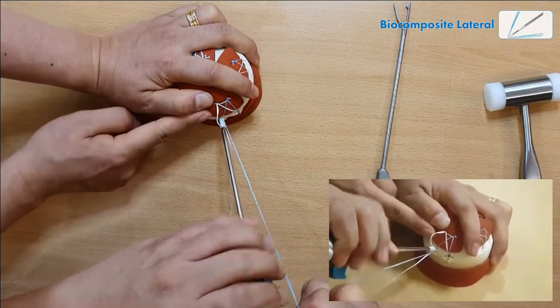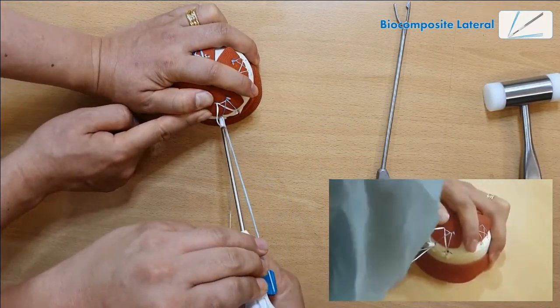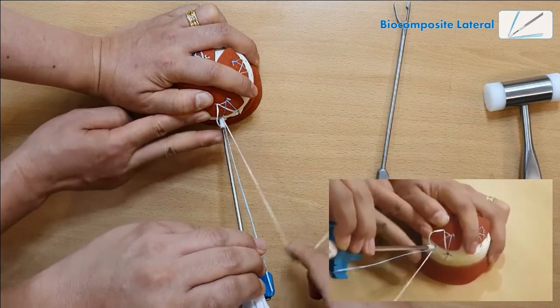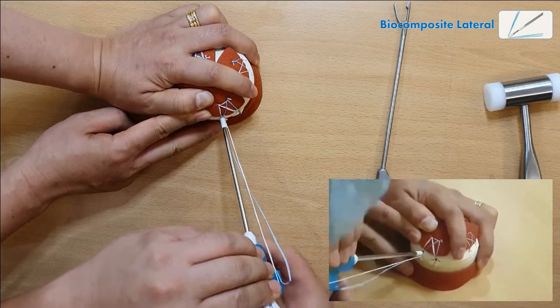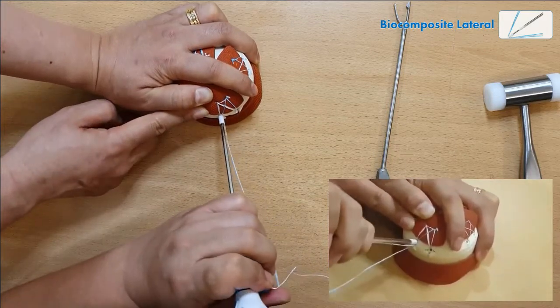Now pull it to give the tension that you want and then screw it in.